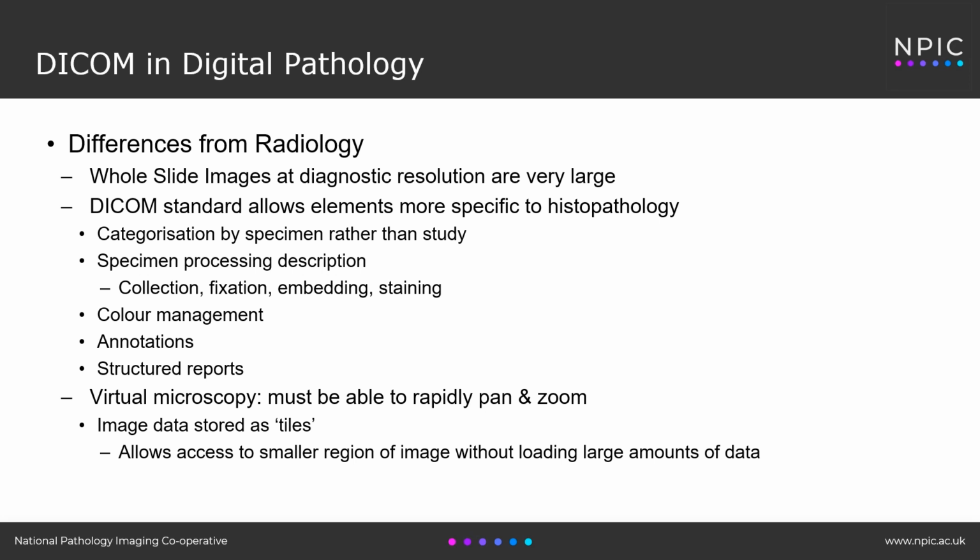The standard also allows elements much more specific to histopathology. For example, it allows categorization by specimen rather than study or examination type, which is more common in radiology.